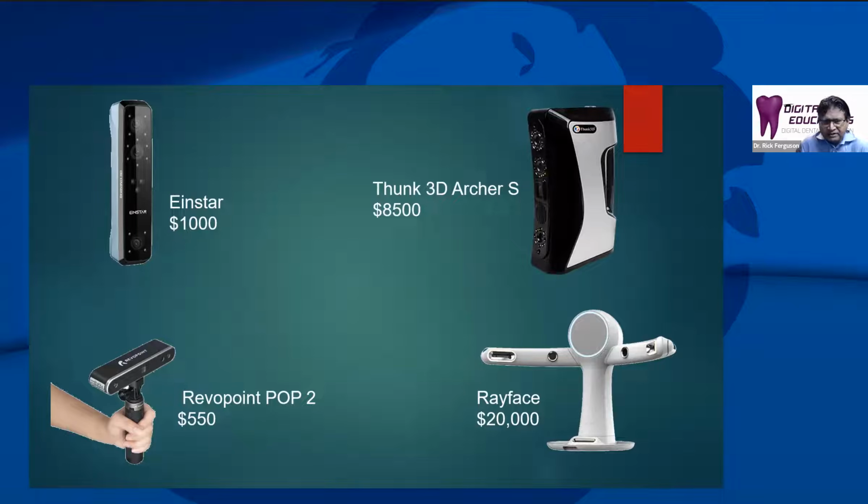So we're really liking that machine. And also we've used the Thunk 3D Archer S scanner, which is basically the scanner that the folks at Instarisa are using. You can buy this directly from several dealers in the US. It's a price point of about $8,500.